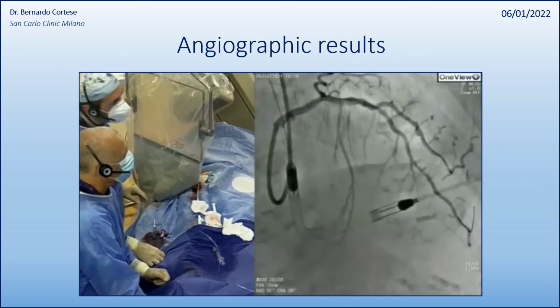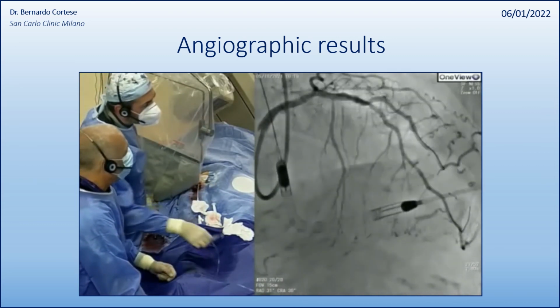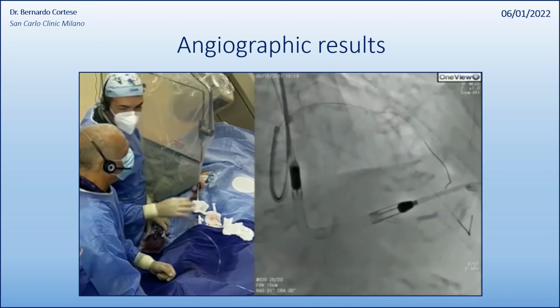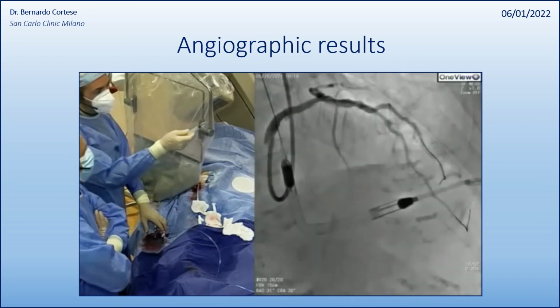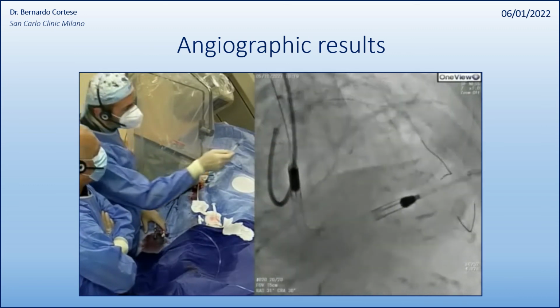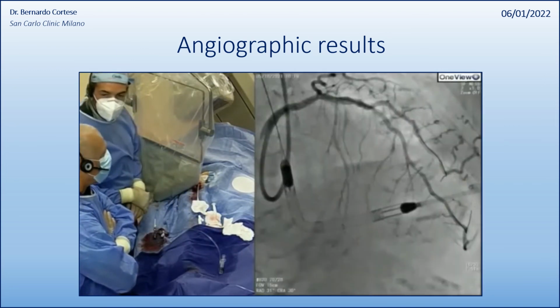Also the collateral flow is much better. Then we have another thing: it has improved the flow in the right coronary artery, and we have not done any nitrate in the coronary, so this is important. And I have to see another thing, that we have that huge septal branch, which could be occluded if we implanted a stent there. And that is a very important branch for the patient. So I think I'm satisfied with the result.